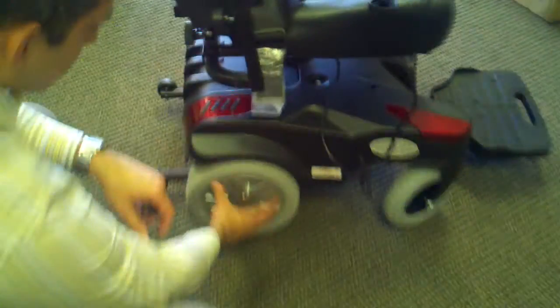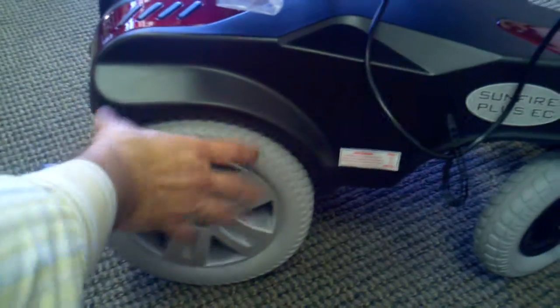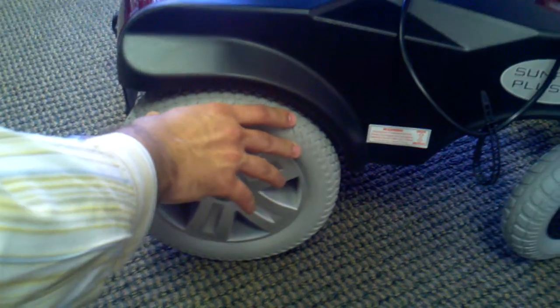Alright, Nate, you're on. This is a rear wheel drive. It's the Sunfire EC. And explain to our listeners what a rear wheel drive versus a center versus a front wheel drive. Well, there's a few different types of power wheelchairs. This is a rear wheel, which means that the motors are actually based in the rear. There's a couple types. There's a front and a mid wheel. A mid wheel is typically 6 wheels versus the 4. What's nice about the rear wheel is you get a little bit more torque with that. They're a little bit more versatile indoors and out. So that's kind of the features between those.